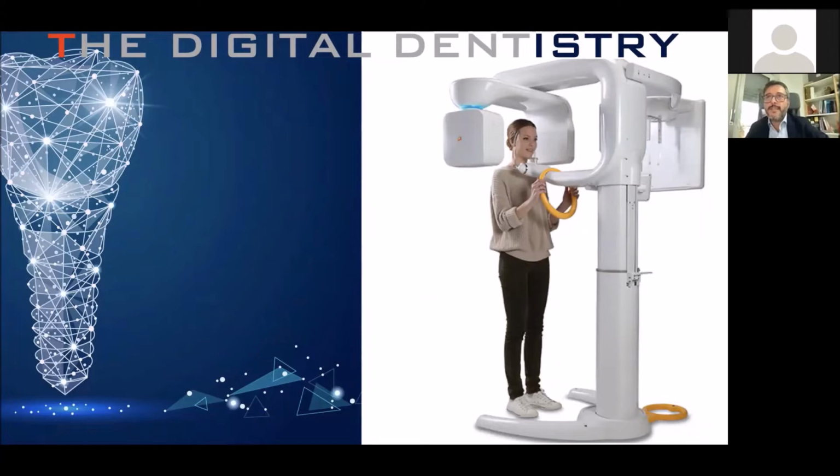The reduction of the dosage for digital compared to film-based radiology is generally accepted. Besides the well-described advantages and achievements of digital radiology, the publication Managing Patient Dose in Digital Radiology cautions against the risks of excessive use of X-ray due to the digital techniques.